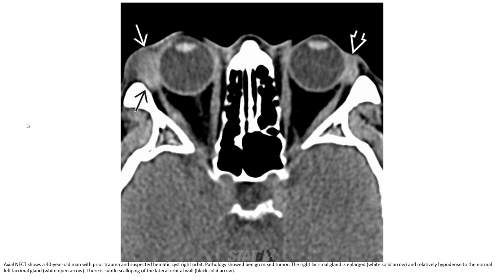The benign mixed tumor of the lacrimal gland is indicated by the white arrow, appearing relatively hypodense to the normal lacrimal gland. There is subtle scalloping of the lateral orbital wall, indicated by the arrowhead.